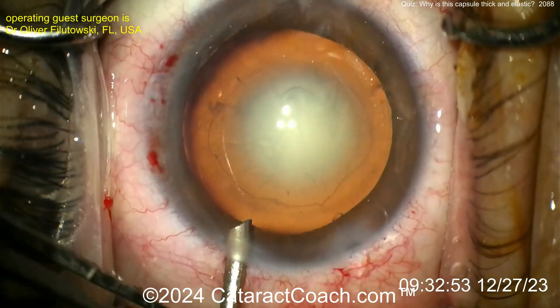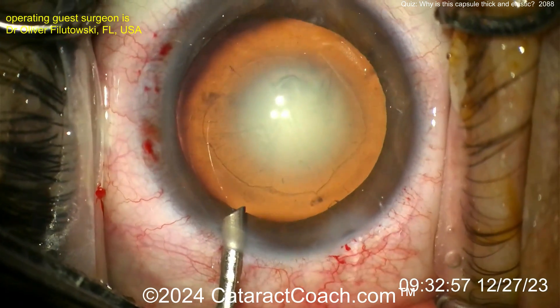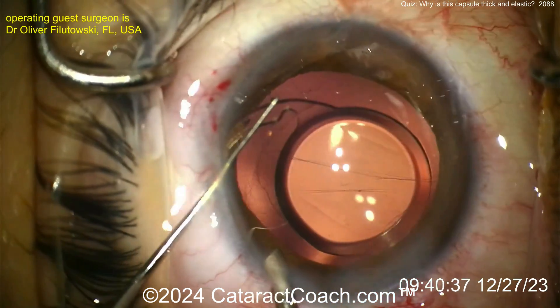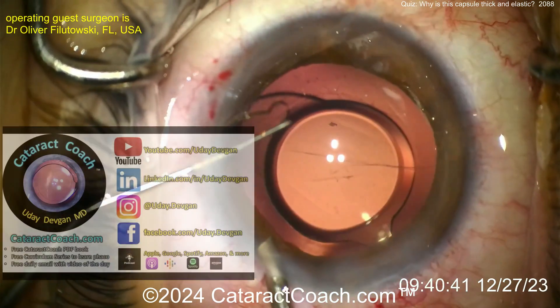Let's cut to the end of the case. Here the IOL is being delivered inside the capsule bag. You can see the capsule bag has a little bit of posterior capsule wrinkling. Let's see what happens as the lens goes in.